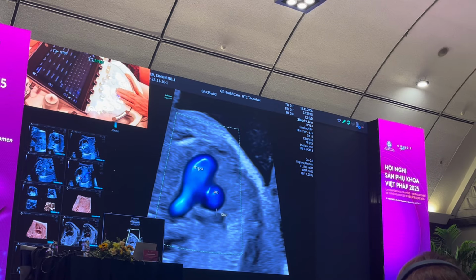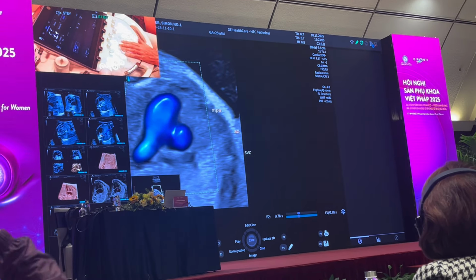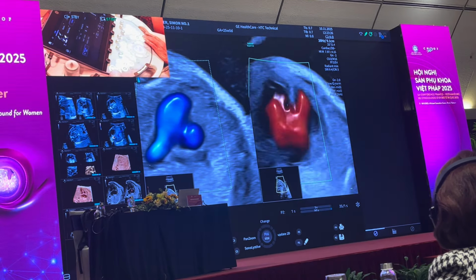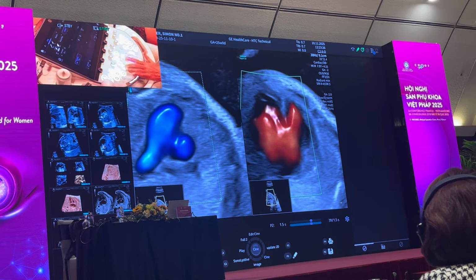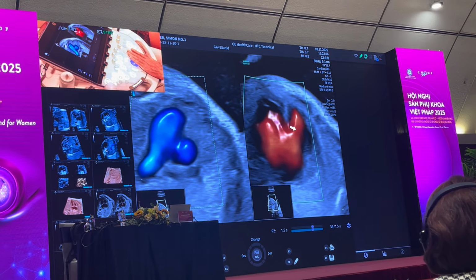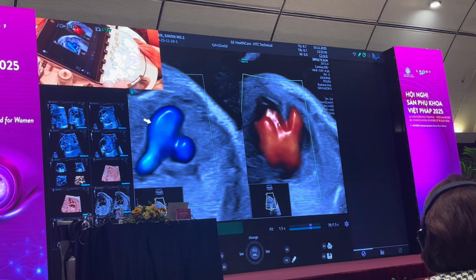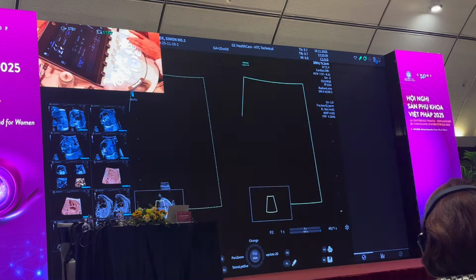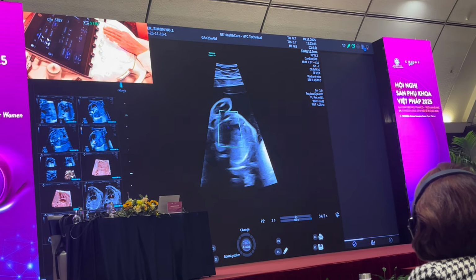And I see the normal relationship of the vessels, which are perfect in their position, and I look at that in reference to the four chamber view of the heart. And I see that the curvature of the vessels coming out is correct. So this is the right ventricle, and the curvature of the pulmonary artery is to the left. So this is normal.